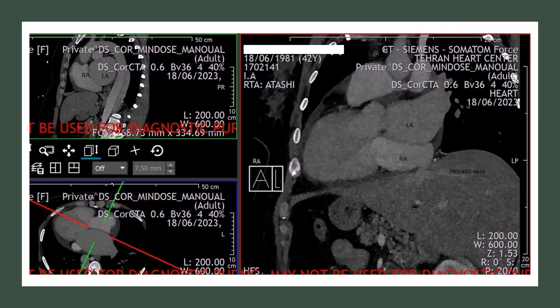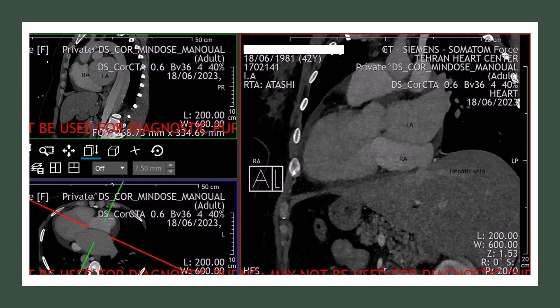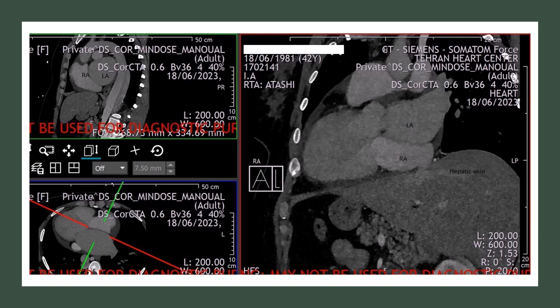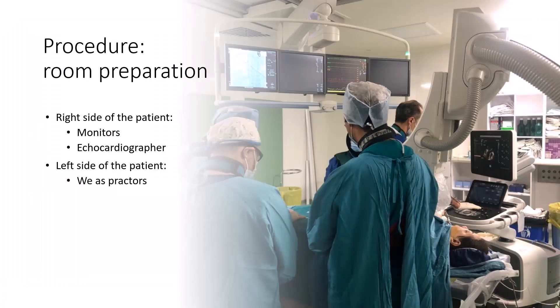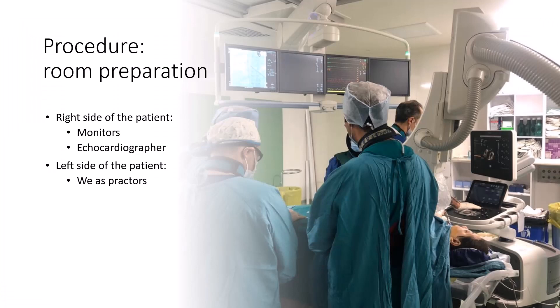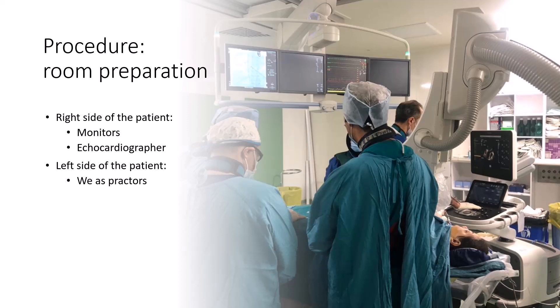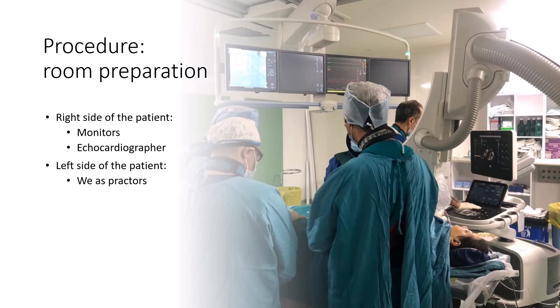Based on detailed CT analysis, the hepatic access rather than access from the jugular vein or retrograde access from the aorta was selected for inter-atrial septostomy and balloon dilation of the mitral valve. As the patient had dextrocardia and our access was from the left hepatic vein on the left side of the patient, we changed our cath lab room setting, placing fluoroscopic monitors and the echocardiographer on the right side, while we stood on the left side of the patient.